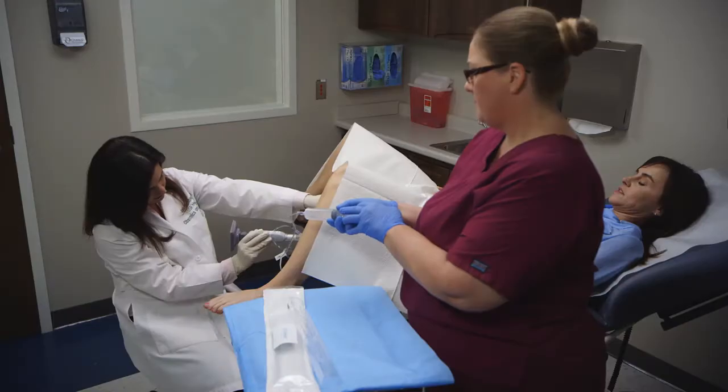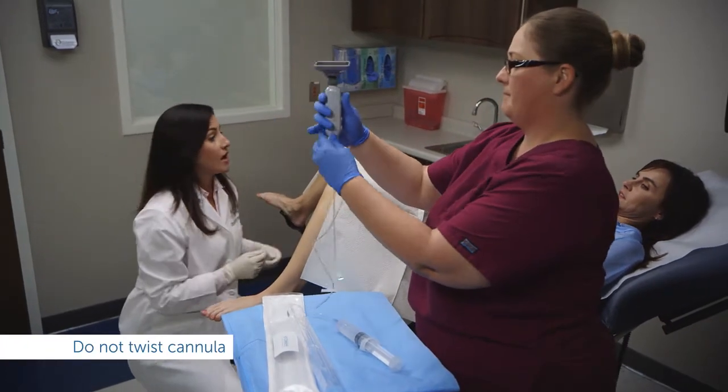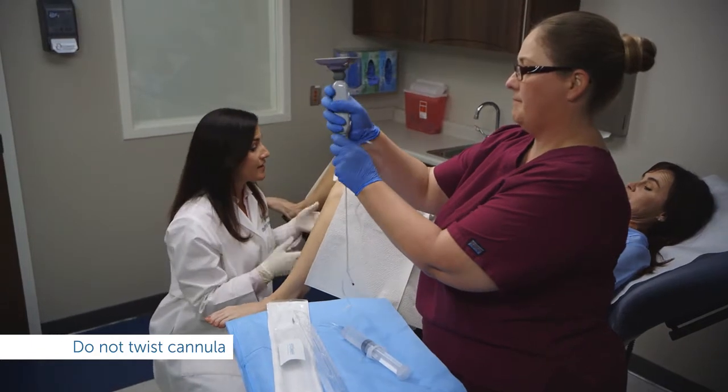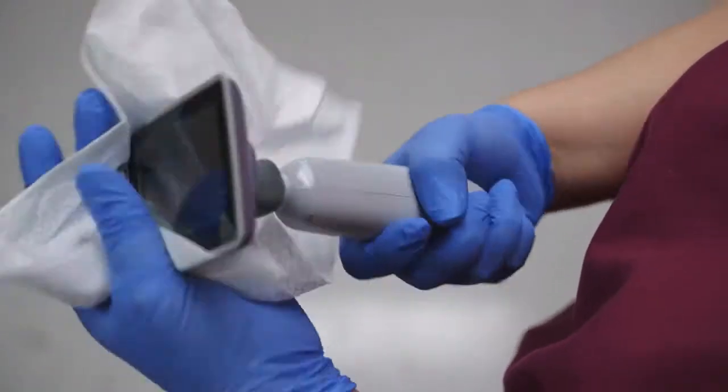Once the procedure is complete, press the power button to turn the system off. Keep the handset vertical with the cannula directed down so fluid doesn't drip onto the handset. Without twisting, remove the cannula by pulling straight out and dispose of it. Then disinfect the handset.